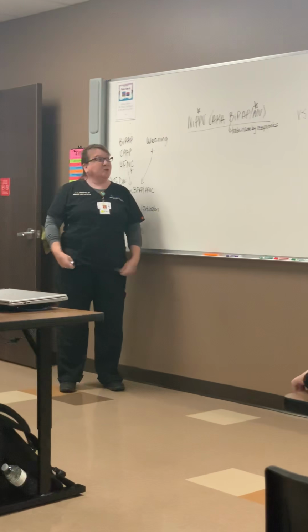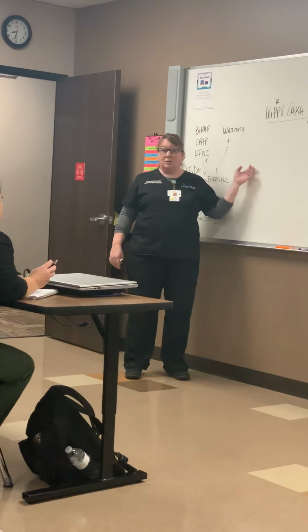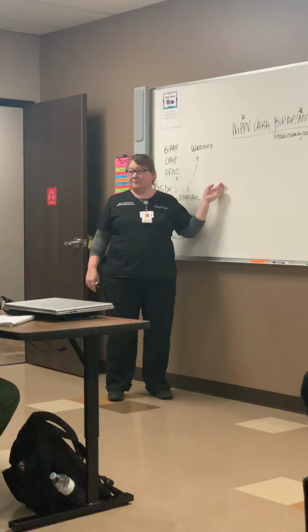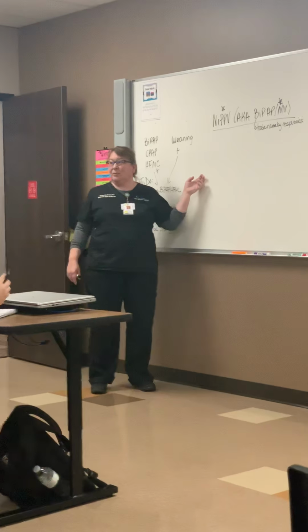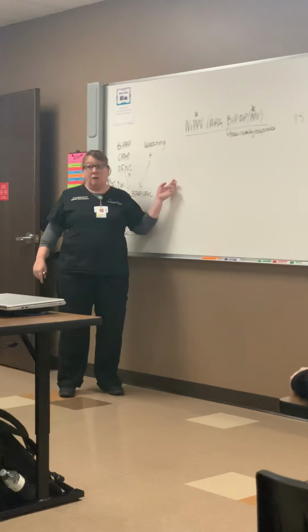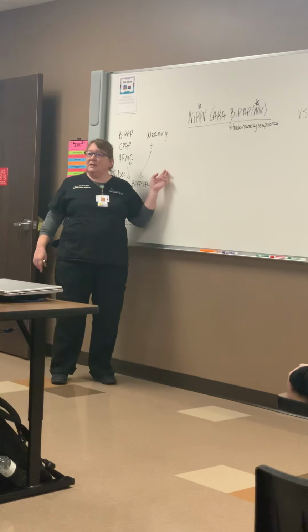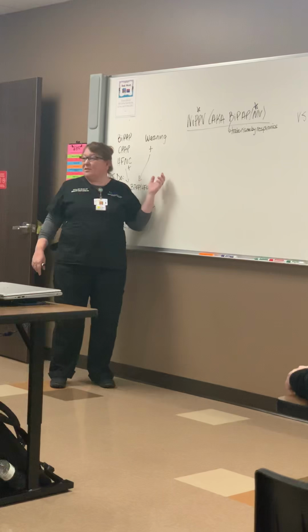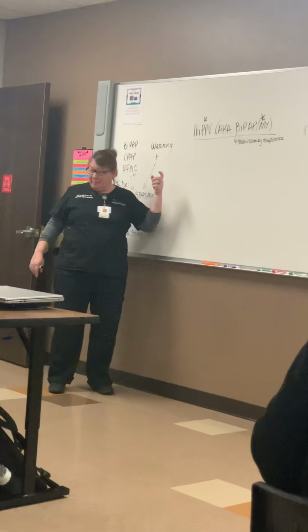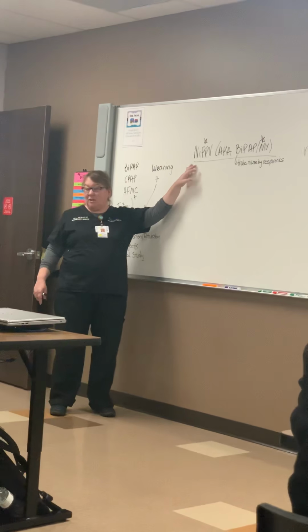Same as your boards. I'm going to try to start getting you used to the names as they're called on the boards, because they don't use any trademark names at all. Everything is a generic name. Like the VEST, high frequency chest wall oscillator, that's the other name of it. So you'll see it as HFCWO, and we'll get into that. So everything's going to be listed by its generic name.